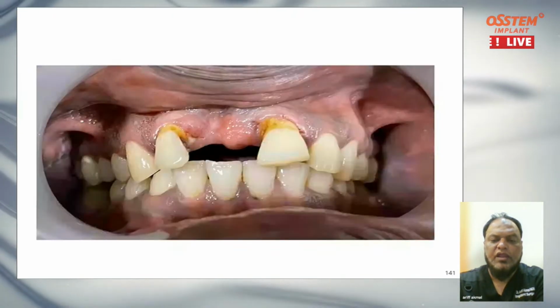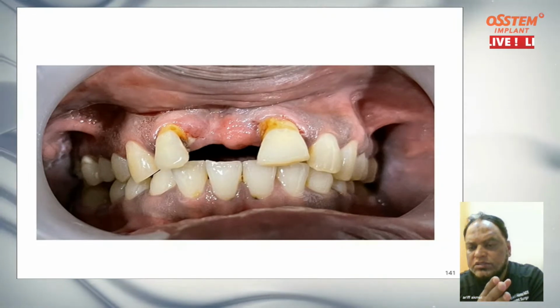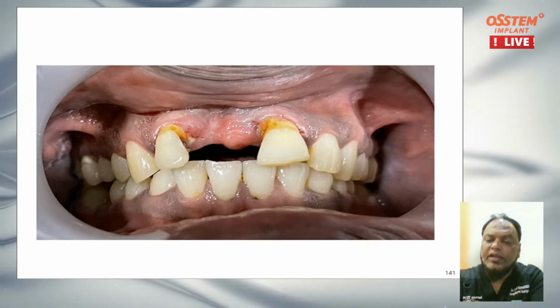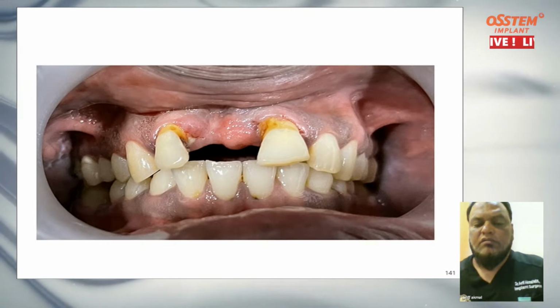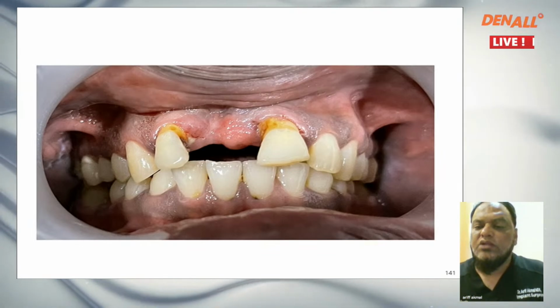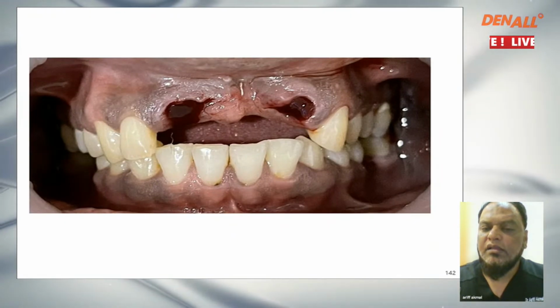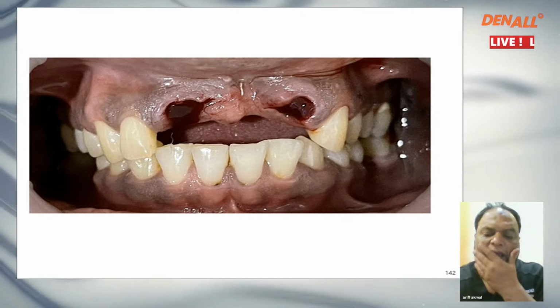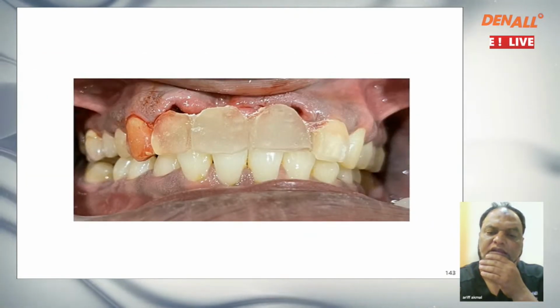Okay. And then we started taking the photographs. See that situation. Because of that flipper which he had used, the adjacent teeth have started moving. They were almost at grade 3 mobility. The patient is not laughing, is not talking comfortably. We extracted the teeth. We prepared a surgical stent because this was done long back, so there was no digital dentistry at that time.